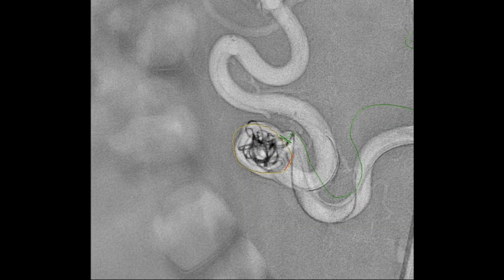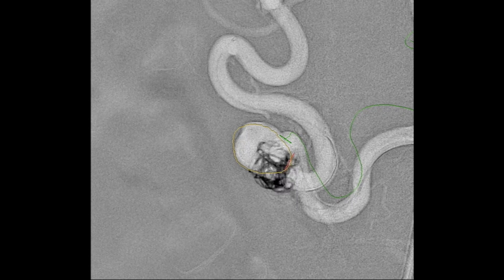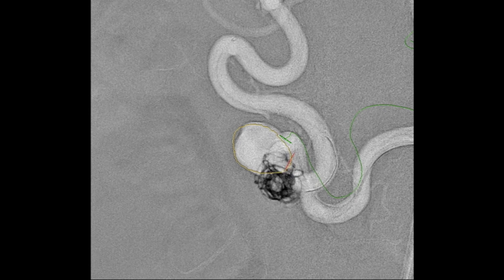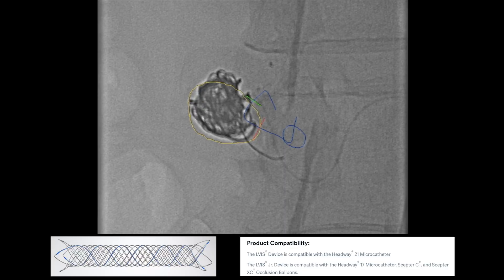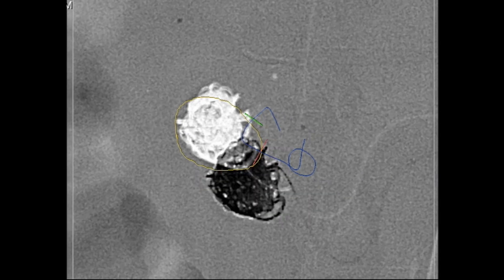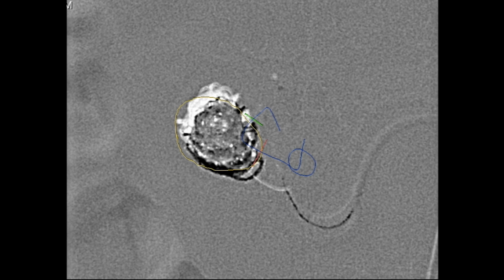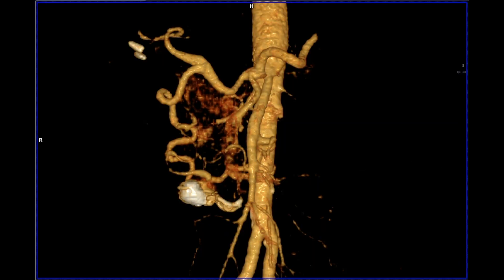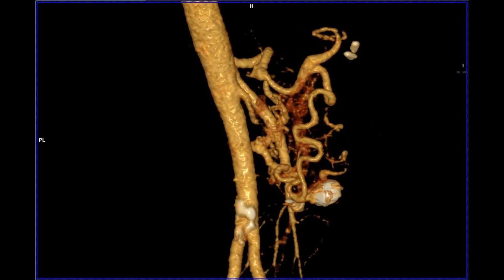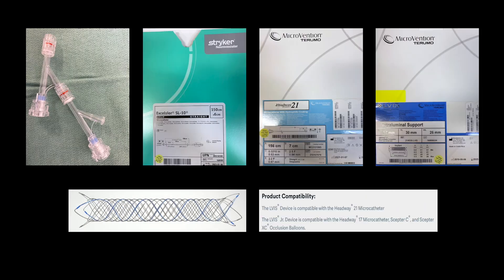Coils were packed and placed during full expiration. Once satisfied with the coil support, you then bring in the stent — the LVIS device, which is not post-dilated; you simply lay it in through a microcatheter. At one month follow-up, the aneurysm is occluded and still intact. Comparing pre- and post-images side by side, you can see the approach pathway: we've lost filling of the aneurysm, but the anterior division remains intact. Here are the products used during this case.